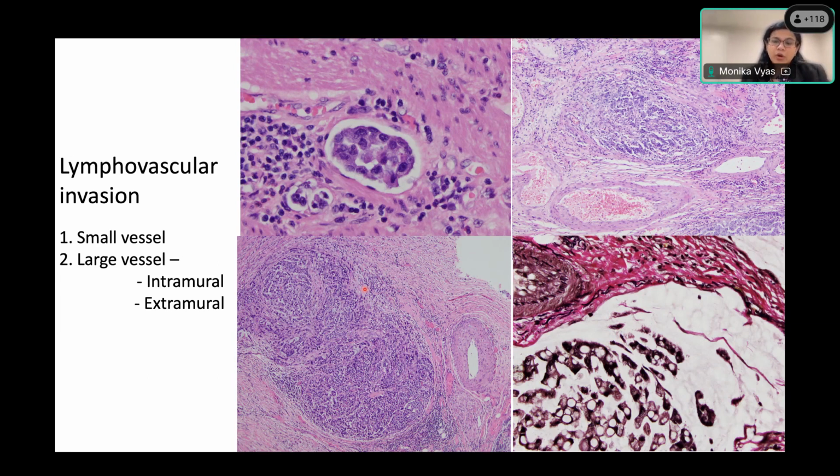So one common strategy that many pathologists employ is whenever you see a T3 tumor, that is a tumor which is going beyond the muscle layer and involving the pericolic fat, you do an elastic stain on those blocks and see if you can find any extramural large vessel invasion. It's not completely justified. Some pathologists also try to do it if they have a suspicion of large venous invasion, and that's fine too.